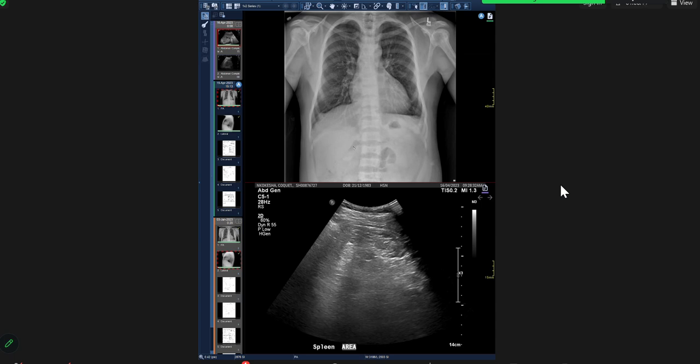Since you didn't see a cause here, you would tell the physician that this is a patient of probably known sickle cell anemia, and you would say that I would see the previous radiographs to make sure that this is a diagnosed patient, because definitely the patient is now 40 years, so he would be diagnosed by now. So you say that I don't see much here, but given that the patient has chest pain and background of sickle cell anemia, these are the things I would be looking for.